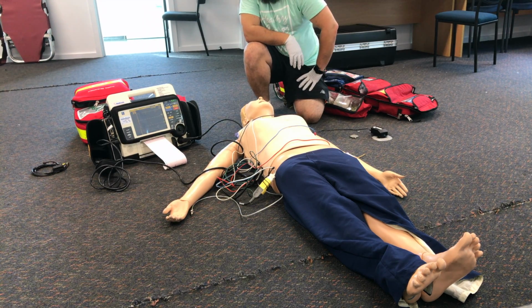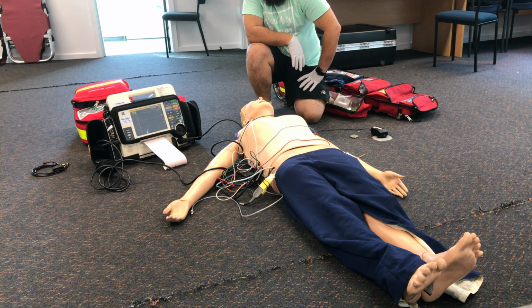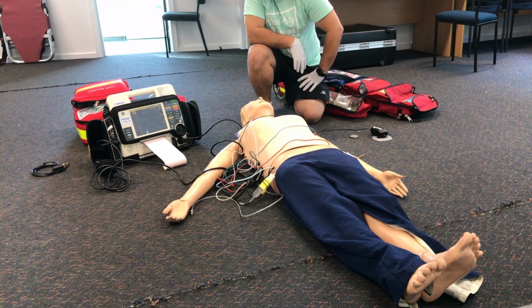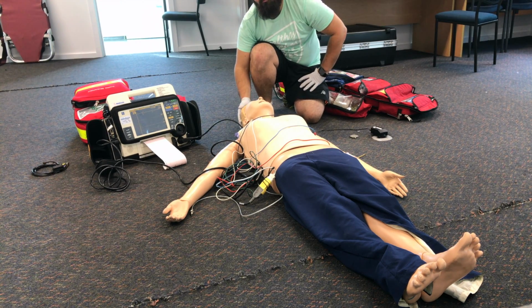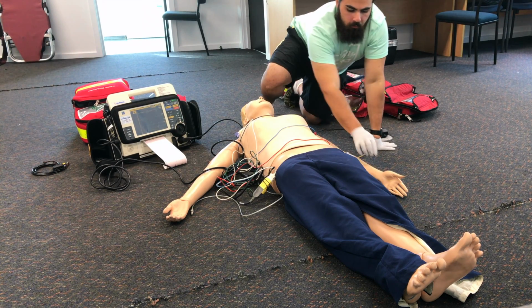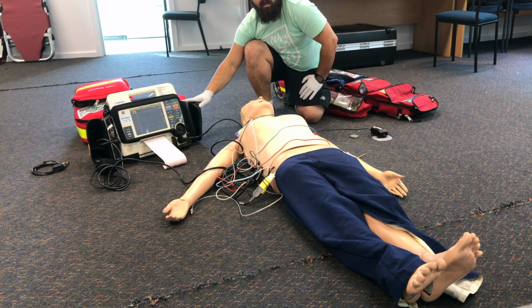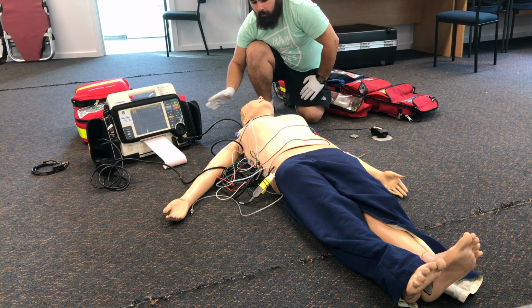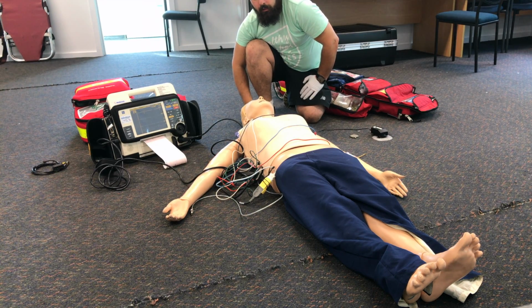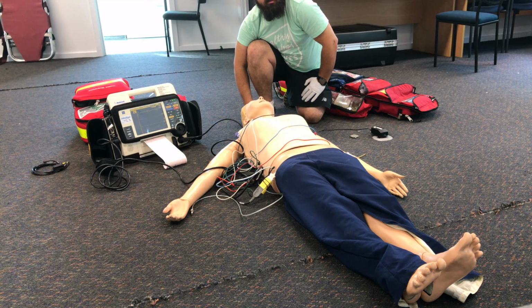So the next step is to figure out how much compromise this patient has. In talking to him before, he was quite confused and not able to follow commands. So we'll give him a GCS of about 12. I've had a feel for his radials, and he doesn't have any radials. His blood pressure has come back as unrecordable, and he's looking very pale and sweaty. So I would class him as severe compromise. Combine that with his wide complex bradycardia, and he's a candidate for pacing.